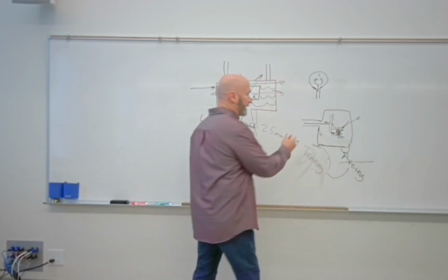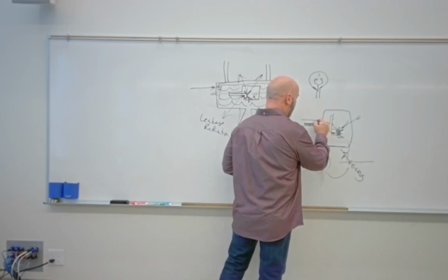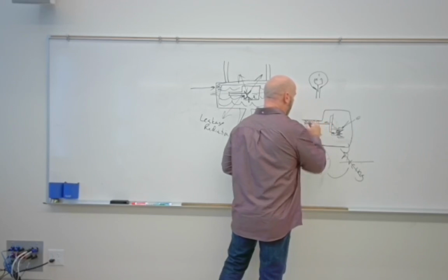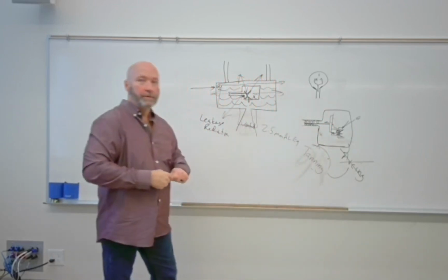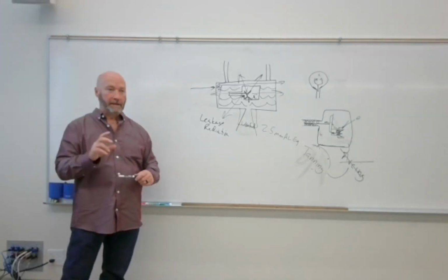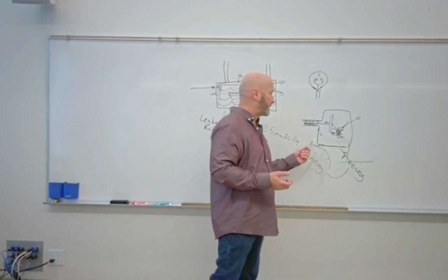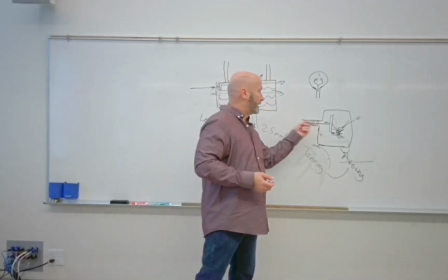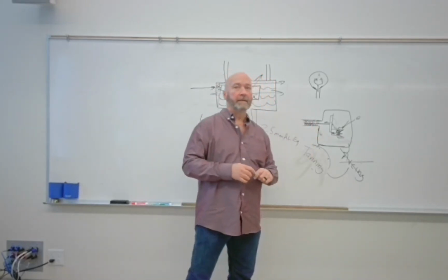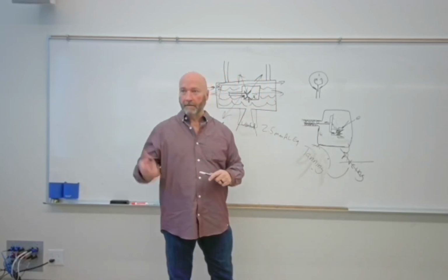And a reason for that is this has to rotate on something. So we've got bearings back here, okay, and they're oiled, they're well greased, and you saw how well it rotated, right? It takes almost nothing to make it rotate. So we've got these bearings and they're well greased, but as they get hot, that grease wears out.